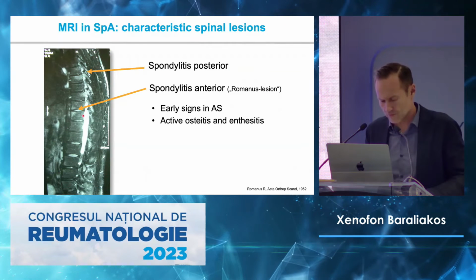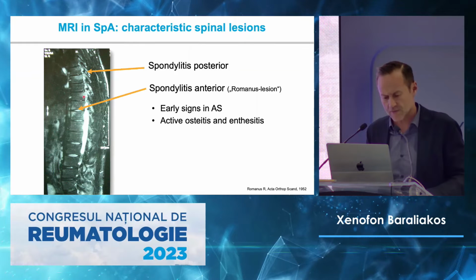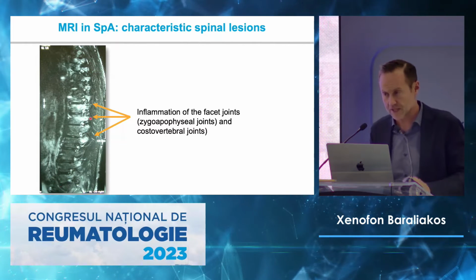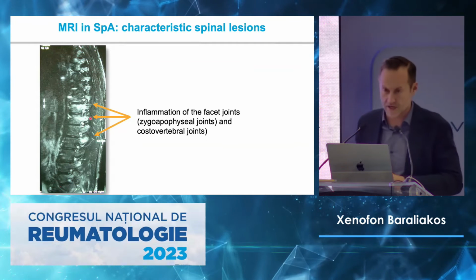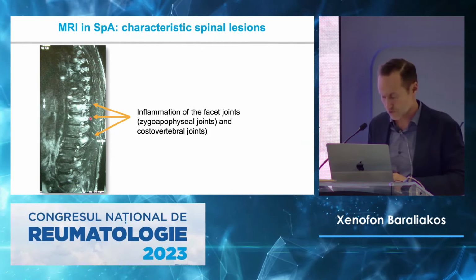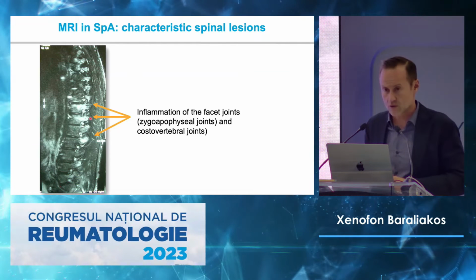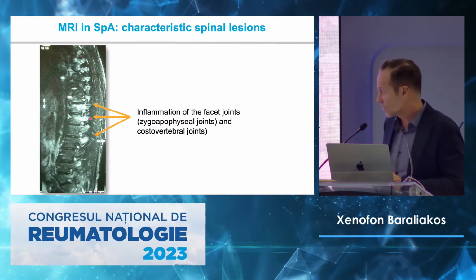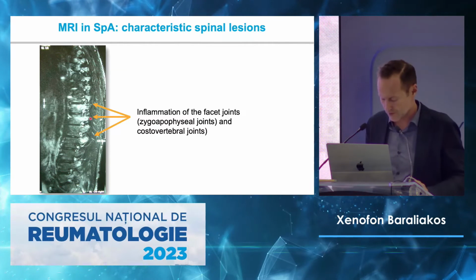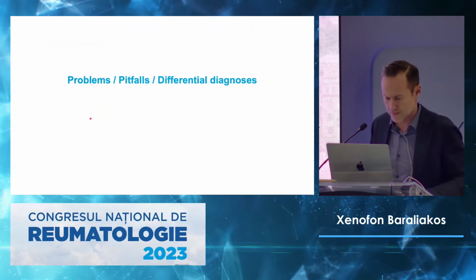And now let's say for the record, you may see spondylitis in the front, in the back. You may see facet joint involvement only. There are many different things we will see in those MRIs, and all of them count as positive images or lesions for spondyloarthritis if the symptoms are correct. We heard that also in the previous presentations for both the MRI and the periphery. We need to see these lesions in the context of the symptoms.